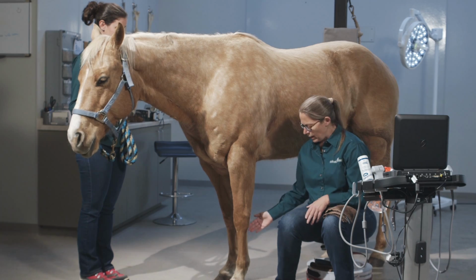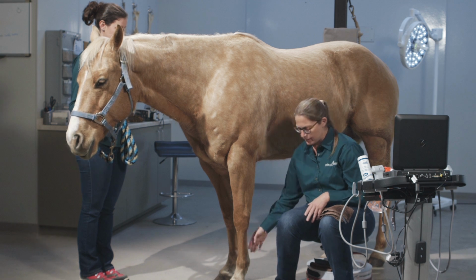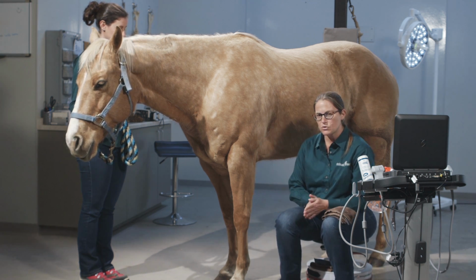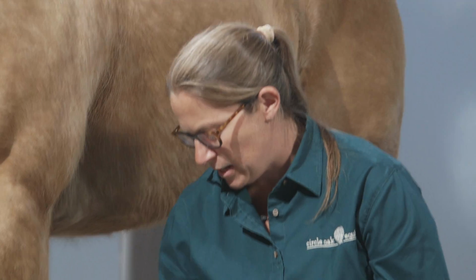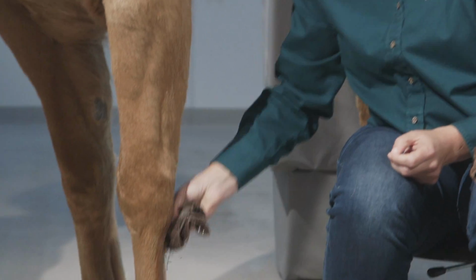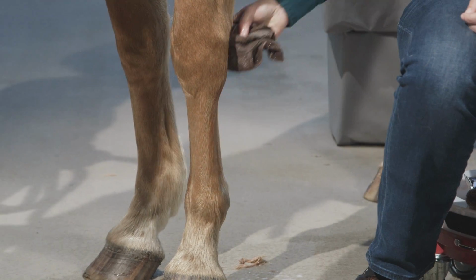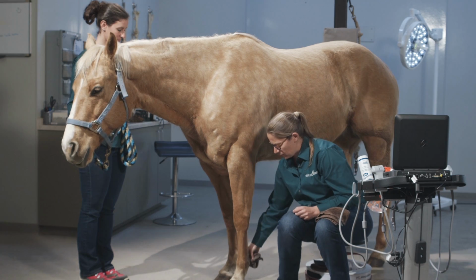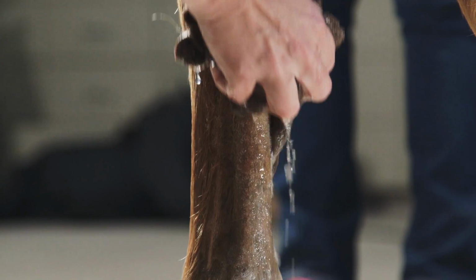standoff. So after I've clipped an area with a 10 blade, then I go ahead and scrub it really well to get rid of all of the dirt and the debris and hair from the clipping. And again, I'll scrub outside of my clipped area to make sure that I'm not going to drag any of the dirt and the debris into the clipped area, which will decrease image quality again.